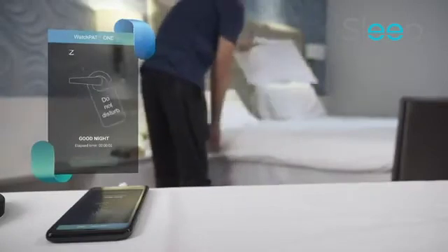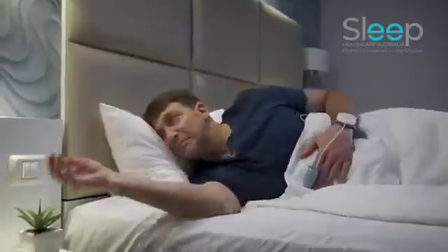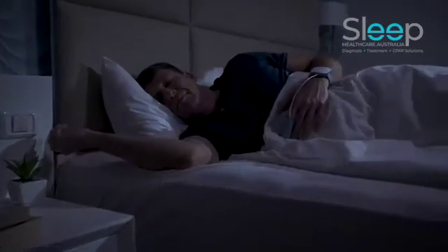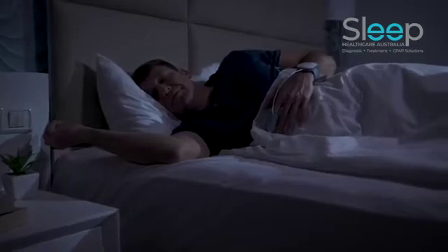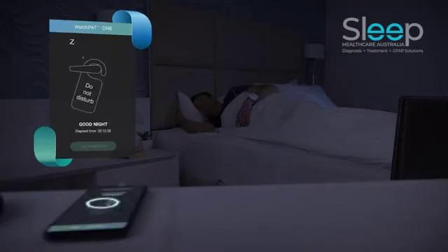It is now time to go to sleep. Good night. If you need to get up during the night for any reason, leave the phone plugged in — there is no need to carry the phone with you. The Watchpat will automatically re-sync with your phone once you re-enter the room.